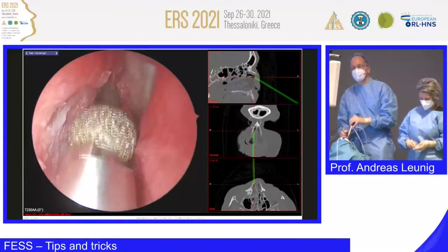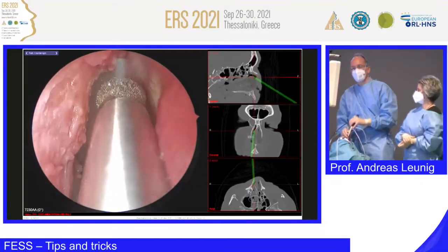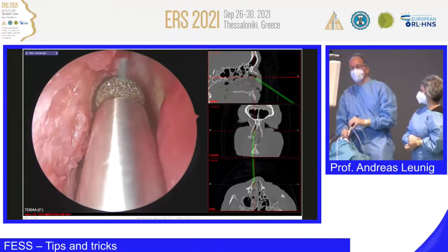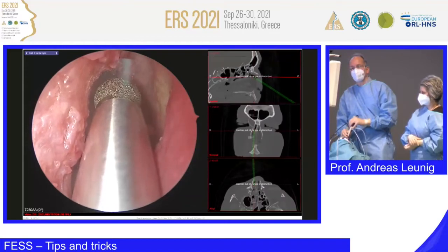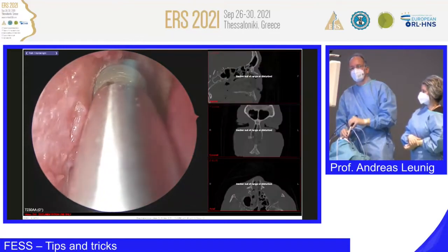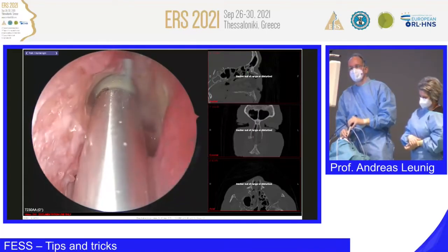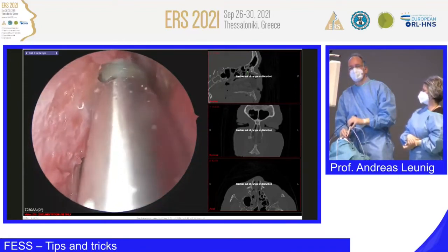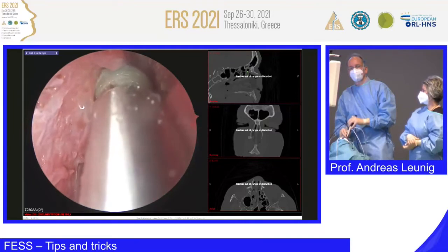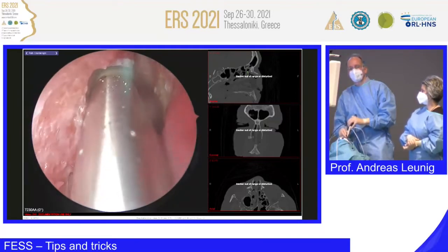And you have this one usable sharp diamonds, and it's 40 degrees bended, and now, okay, you take it, you have irrigation at the tip, you have the suction at the tip, you can do a very gentle opening. Like this here.